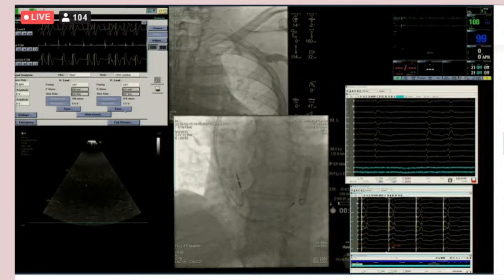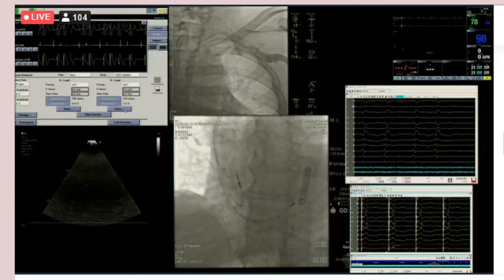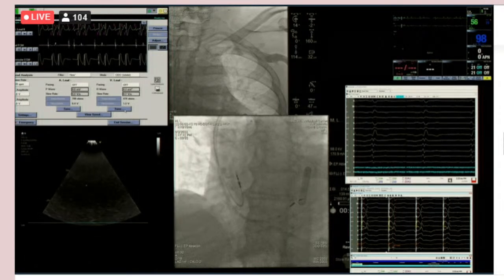I agree with that, and that's what I do. I started to do this in clinical practice. If anyone needs any pacing, I just try the left bundle lead, because like you said, it's easy, it's quick, and it gives you that narrow, perfect physiological QRS. It's easy and it's quick when you put 10, 20 cases into it, and then it's straightforward.